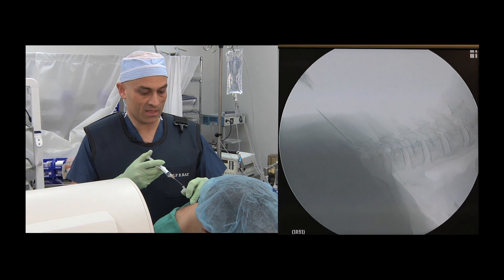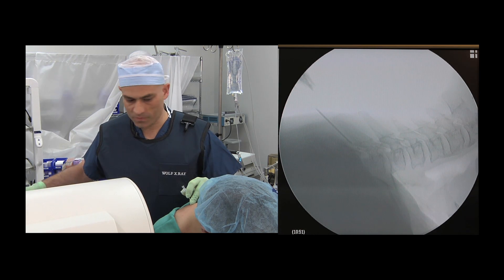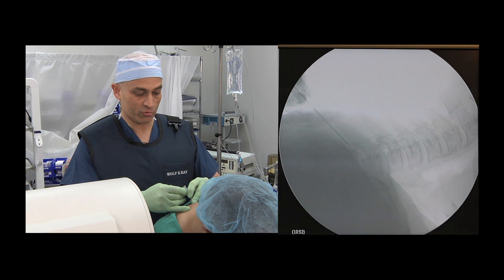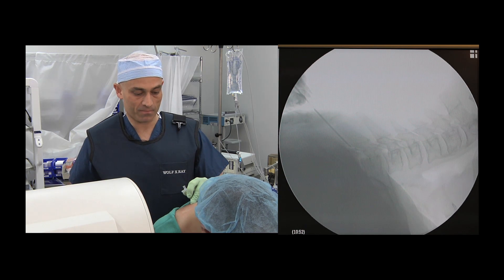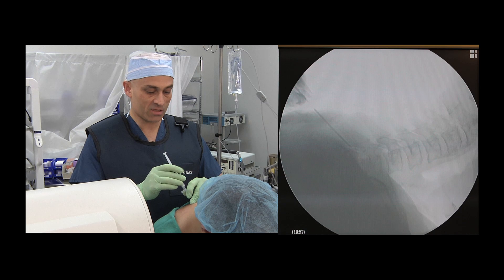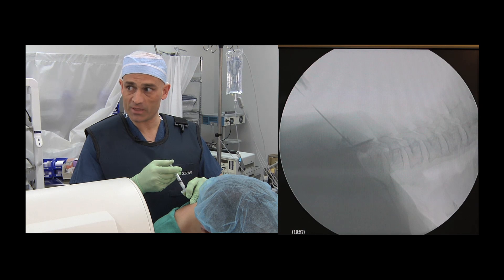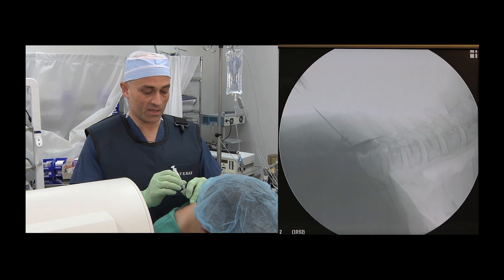The hanging drop technique is used to identify the epidural space. The needle is advanced under fluoroscopic guidance using the hanging drop technique into the epidural space. A contrast solution is then advanced through the needle, and as can be seen from the x-ray, an epidurogram is identified.